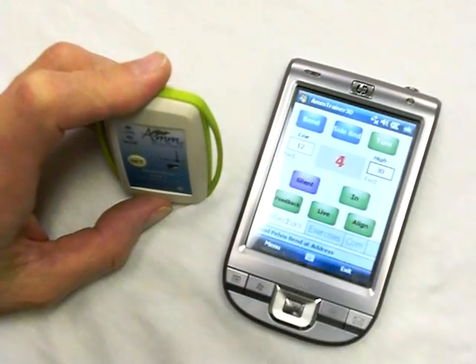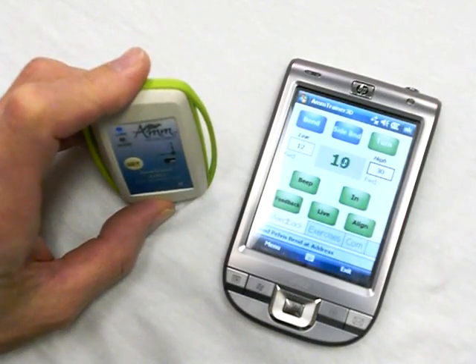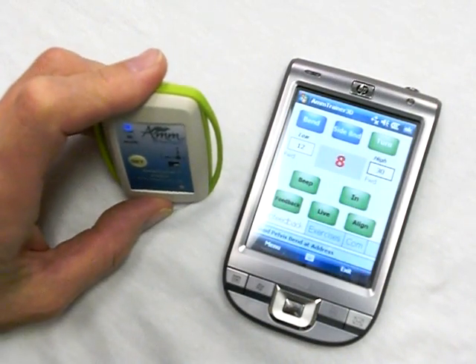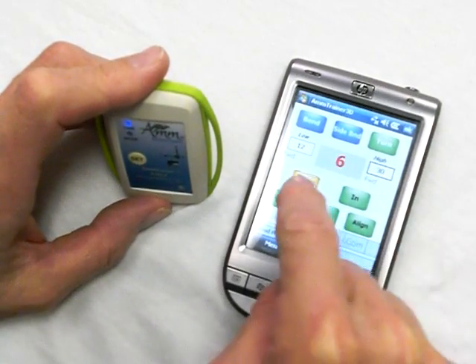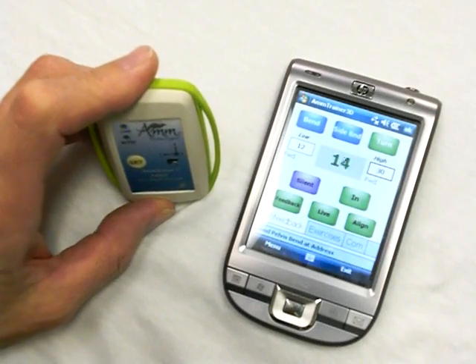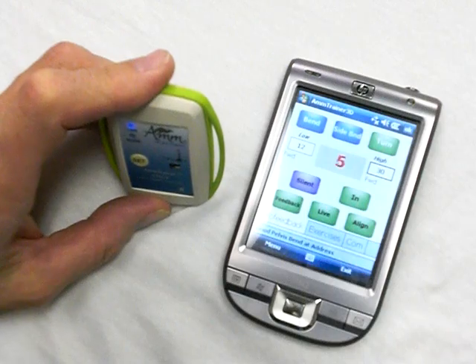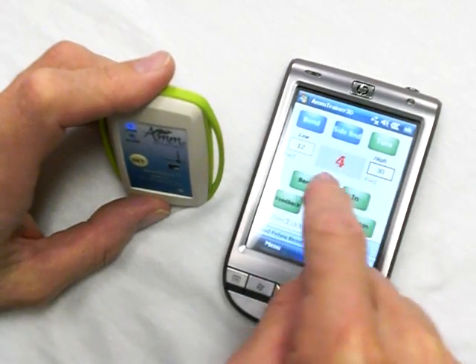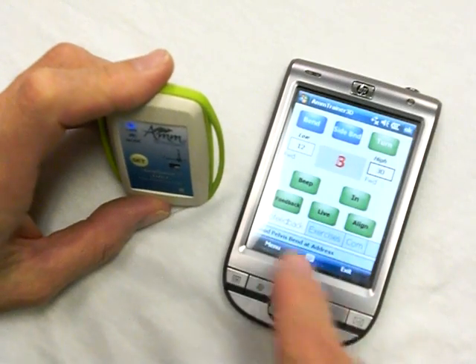Now if I want a negative tone, I can change that to beep. So now it beeps when I'm in zone. If I want to just do visual biofeedback, where all I want to see is the green, then I can turn it to silent. So it's very flexible.